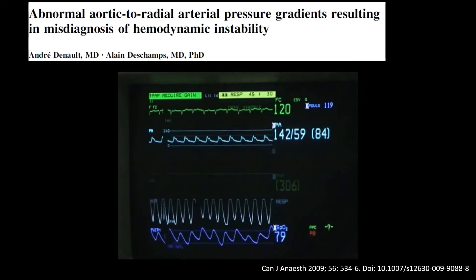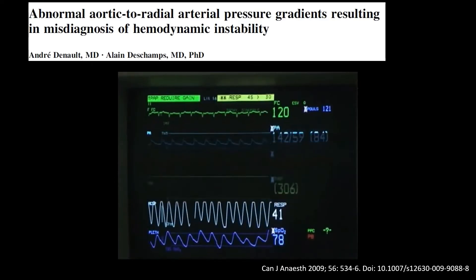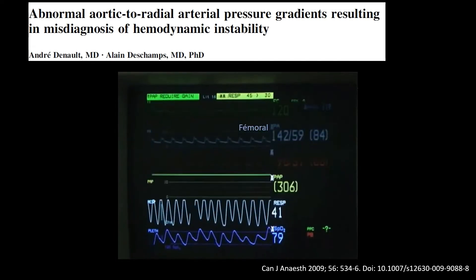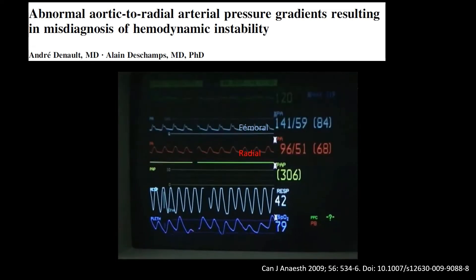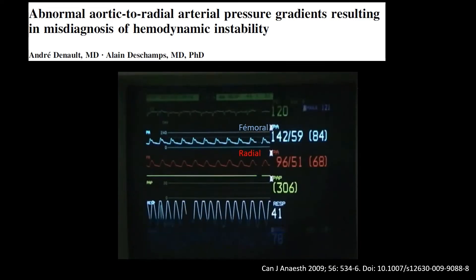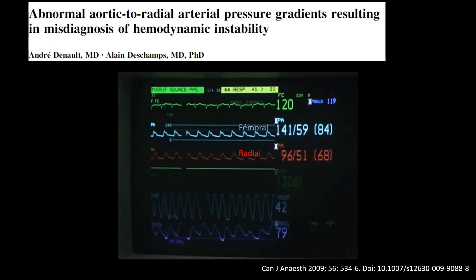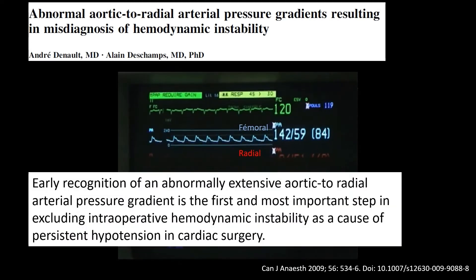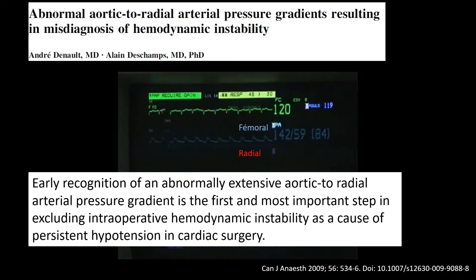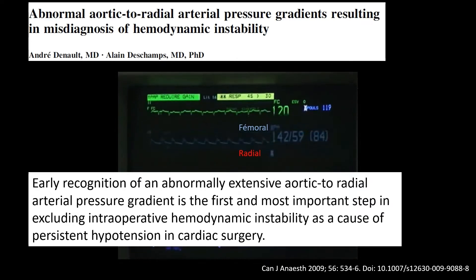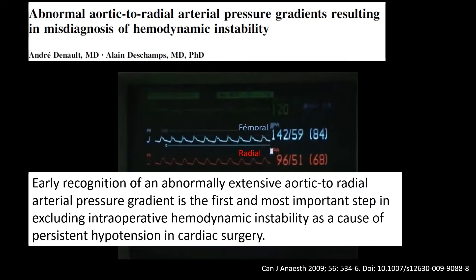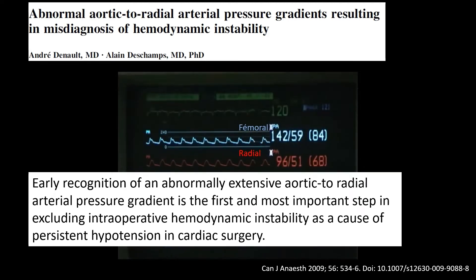In 2009, we published with my colleague Alain Deschamps this article showing a patient after mitral valve surgery — those are the femoral and radial artery pressures. Note the systolic gradient of 46 mmHg. Our conclusion was that early recognition of an abnormal extensive aortic-to-radial arterial pressure gradient is the first and most important step in excluding intraoperative hemodynamic instability as a cause of persistent hypotension in cardiac surgery.